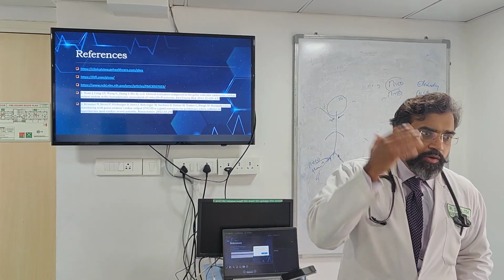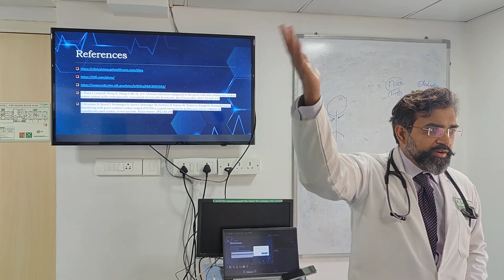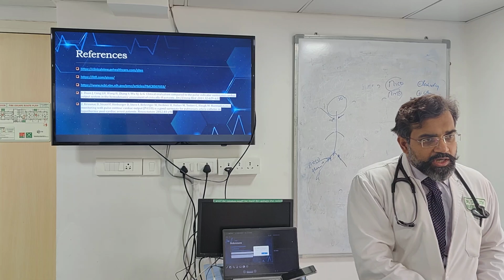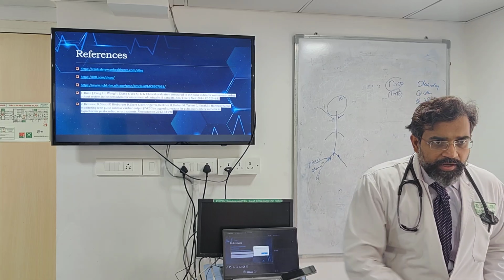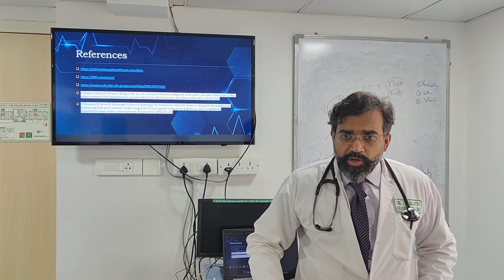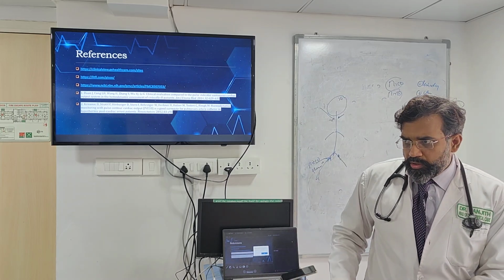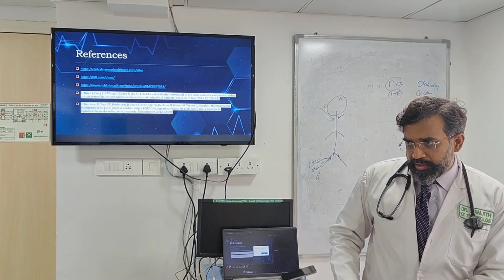This line is used for the Swan and whatever they have put for cardiac output, or when they were doing their surgery or something. There is a Swan over here. There is another line over here. And there's just a sheath or something like that. So I have only this place left. So if I have only this place left, I can still use femoral artery and femoral vein.